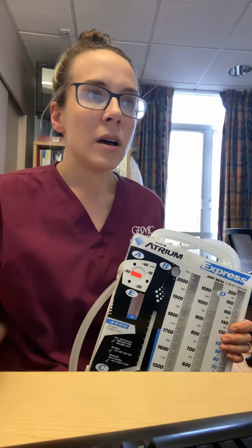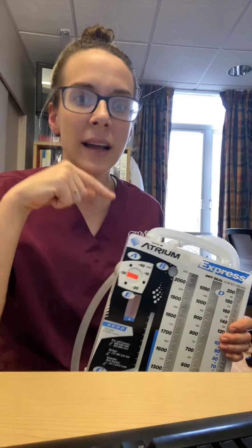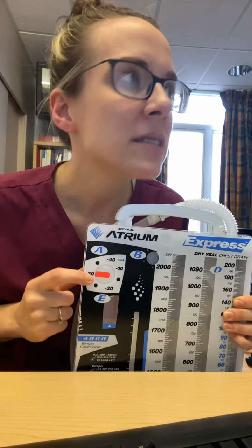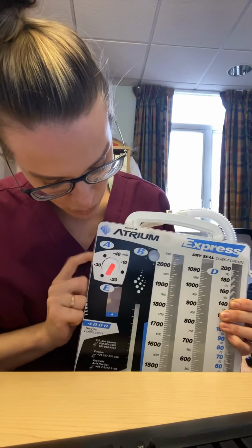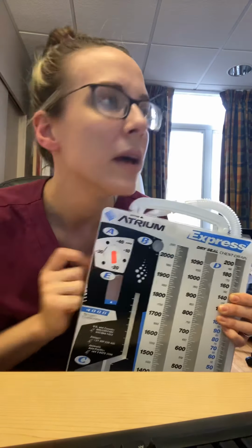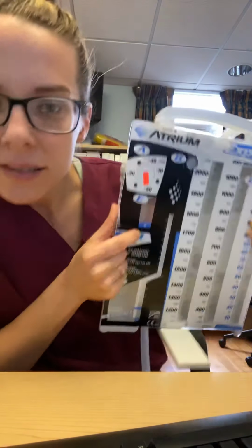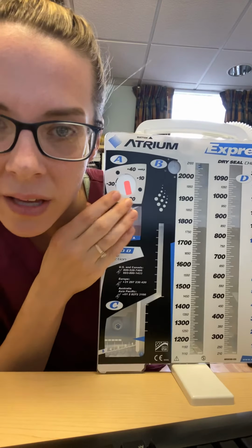Okay, so as long as we have our suction tubing on and the gauge is on, connected to this little lip, we have our suction set where we want it. -30, though most commonly it's -20. So let's switch that to -20 using this little dial. We're making sure that our bellows is at the delta, at this little arrow right here, so we know confidently that we're at -20.